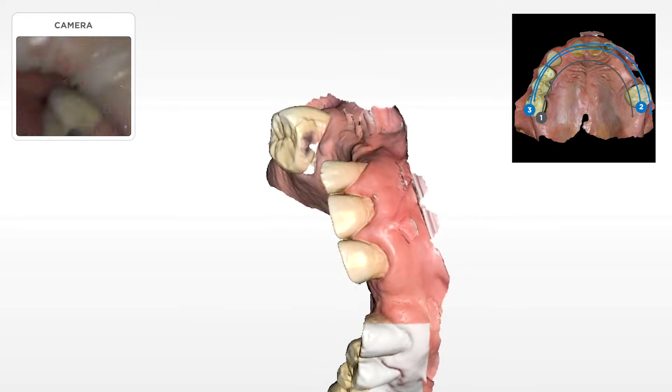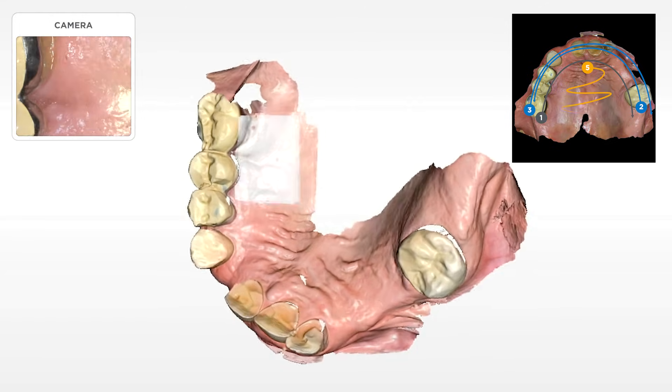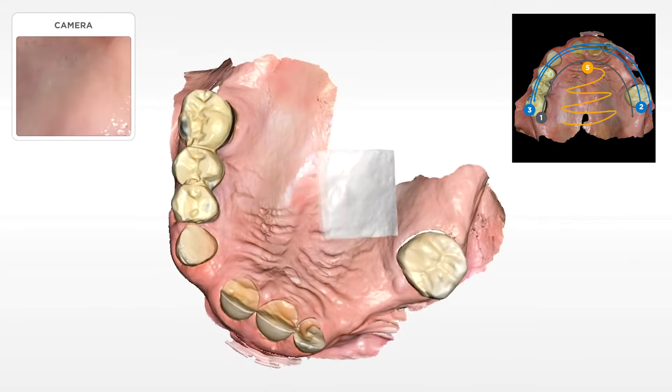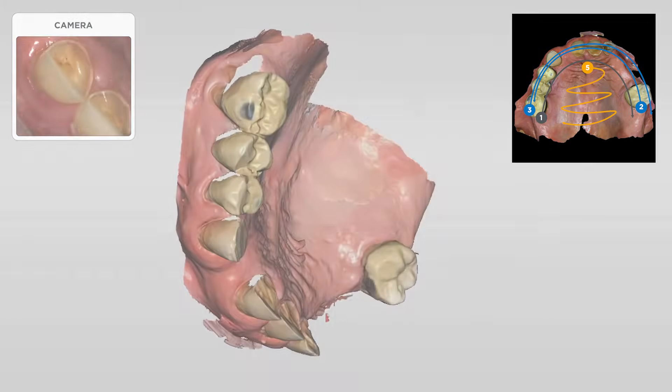Once that gets set, then we're going to go ahead and fill in the palate and fill in the soft tissue. And this can be best done either going back and forth, or you can go straight down the mid-palatine suture and then roll up from either side to fill in the rest of the stuff.